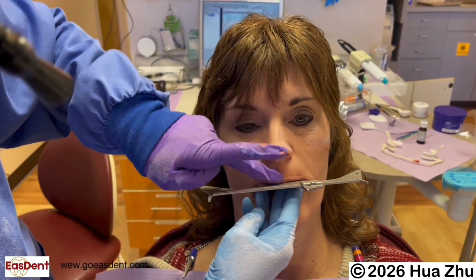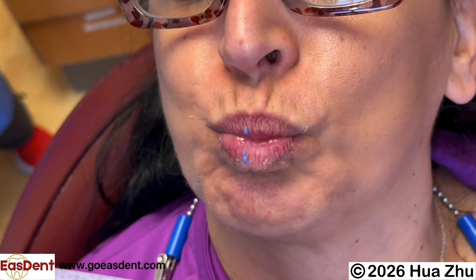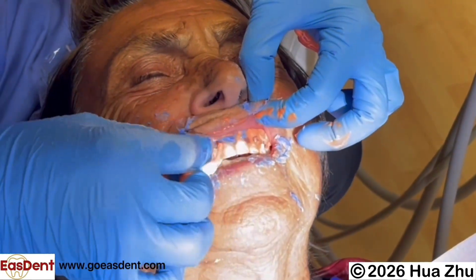Verify the horizontal plane, midline, and buccolingual position of the Easdent teeth. You are able to do minor modification of the teeth position at this step by pushing the tray to your favorable position in case your previously set teeth position is not perfect and you want to change a little bit. Mold the border again with various lip movements. Clean away extra impression material on the teeth before it is set.